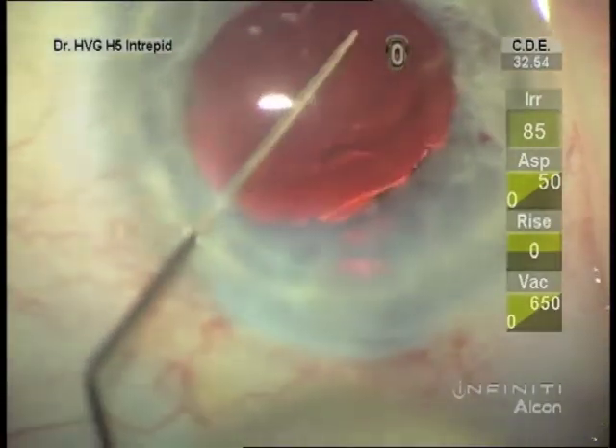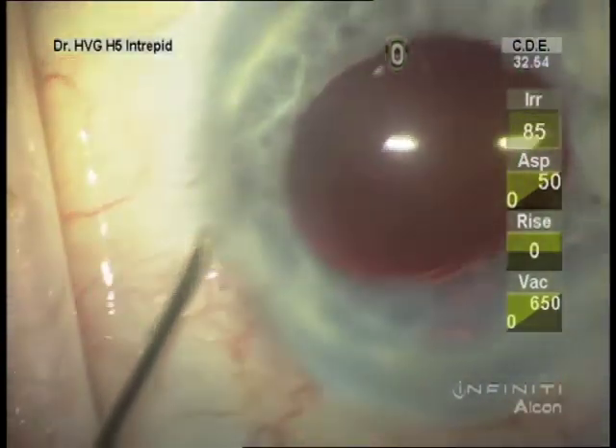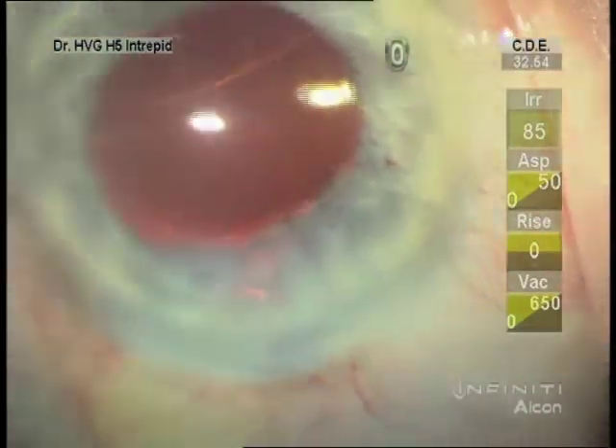There's the antibiotic vancomycin going under the lens. Then after confirming the wound is watertight, I'll add more vancomycin to the anterior chamber.